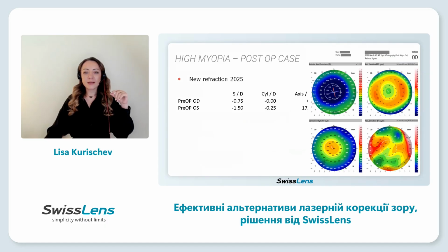Okay, so now take a closer look at this topography. Could the standard lens work here? After LASIK, the peripheral area stays the same, so we know it, but the center is strongly flattened. Choosing a standard lens according to the periphery gives air bubbles in the center, so this is a bad fit.